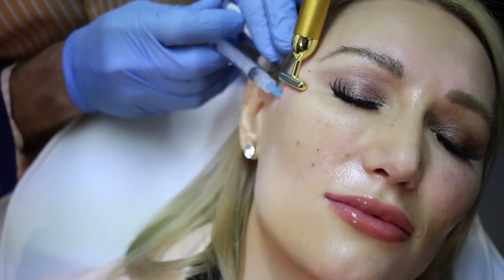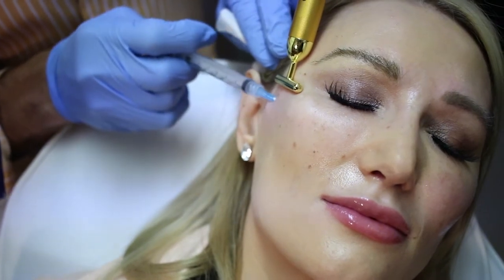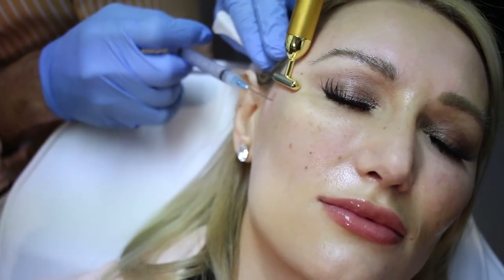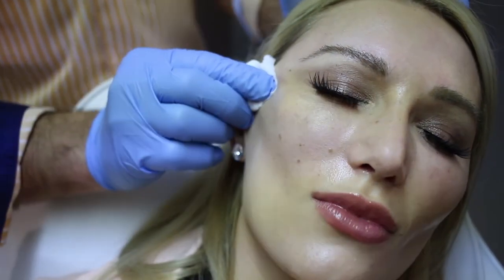Hi, I'm Dr. Ajani and today we're talking about Sculptra. One of the areas where people fail with Sculptra is clogging. The other area is the slow onset of results. It goes in as a water, which is a beautiful thing, because we can blanket areas of the face where we can't use hyaluronic acid fillers because of expense and demarcating lines.